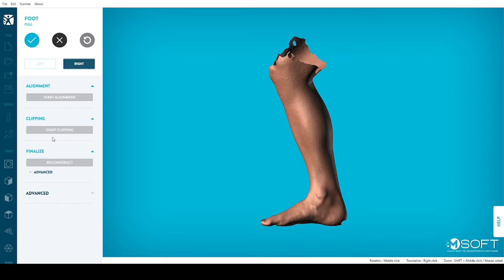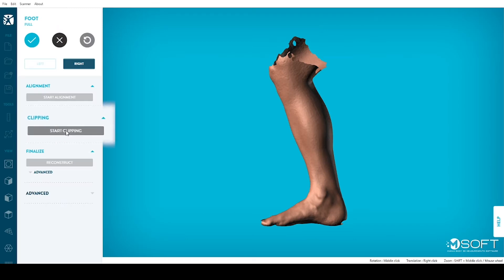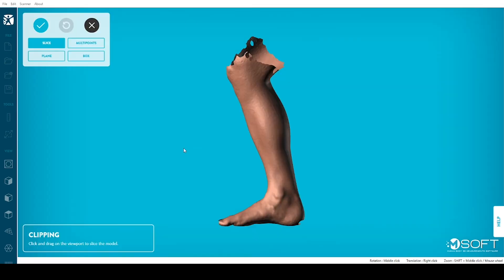Second, click on Start Clipping. Clipping your scan is essential to cut the parts you don't need, resulting in a cleaner model.